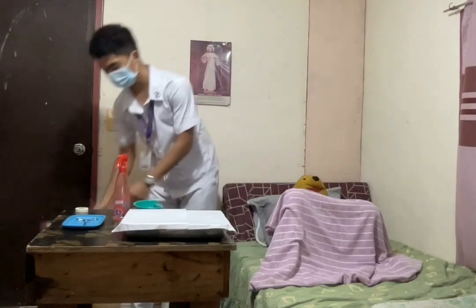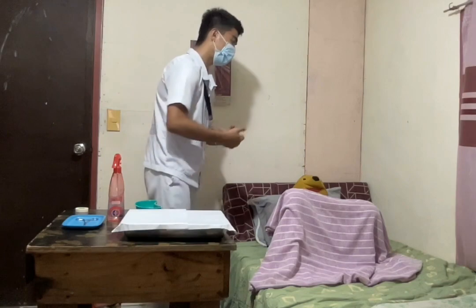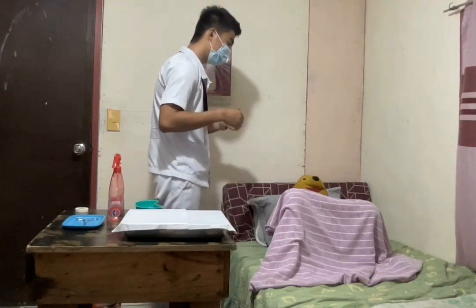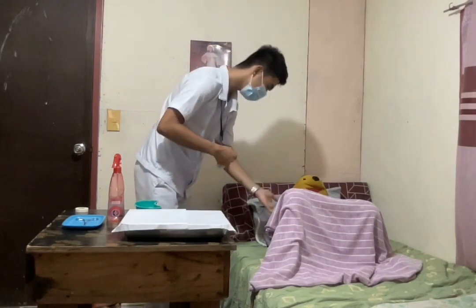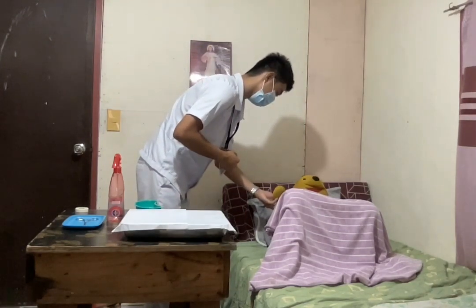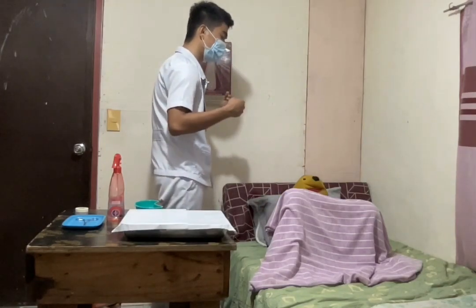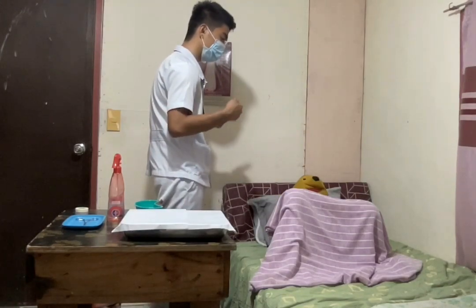Next, I'm going to perform hand hygiene to deter the spread of microorganisms and to avoid cross-contamination between me and my patient. Next, I'm going to identify my patient and explain the procedure. Good morning, ma'am. I am Jim Sergio, your student nurse for today. For the verification, may I see your wristband? And please state your full name and your birthday. Thank you.